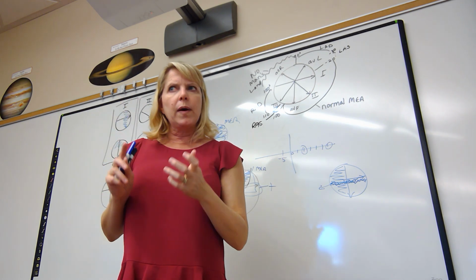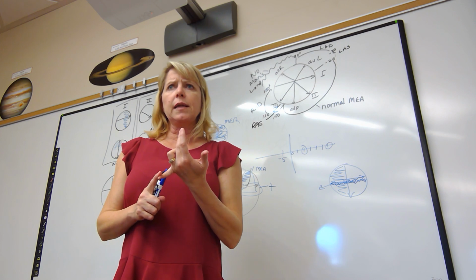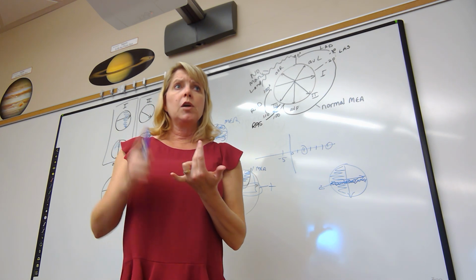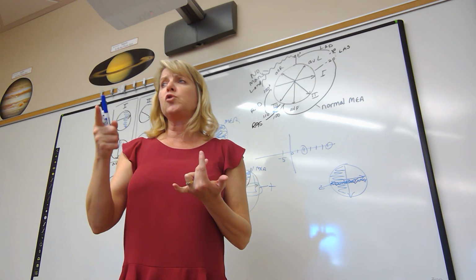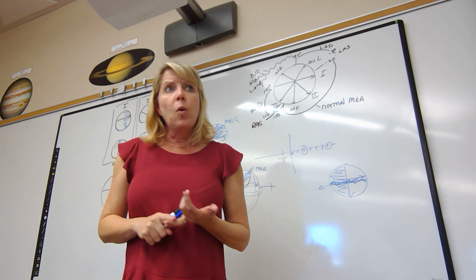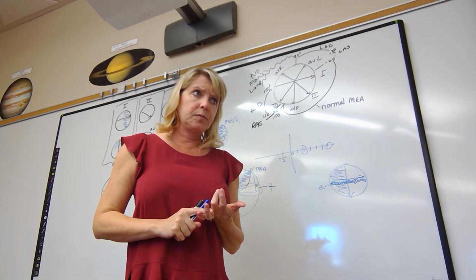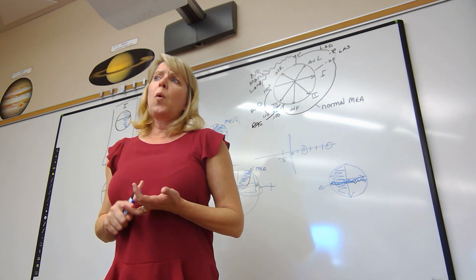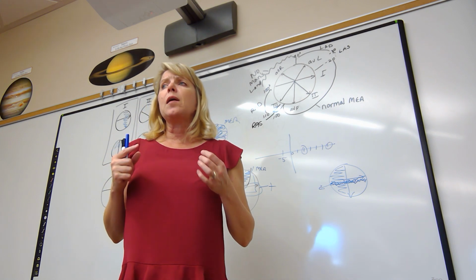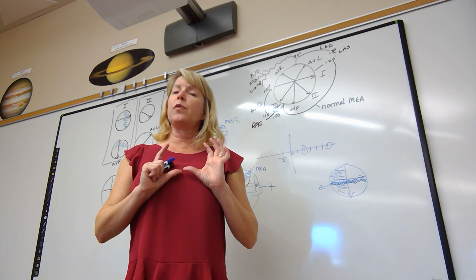If it's 30 points, clear as day, 2 points for calculating heart rate. To remember, 1.5 points for showing me your work on lead 2. 0.5 point for boxing your answer with the correct units. 2 points for calculating someone's MEA using the compass, using leads 1 and 3.